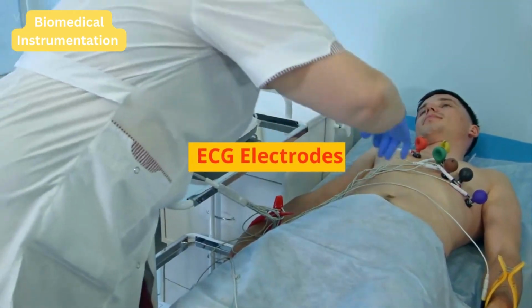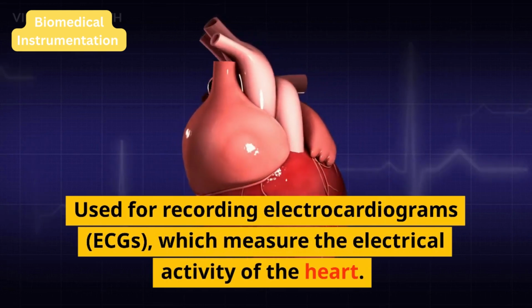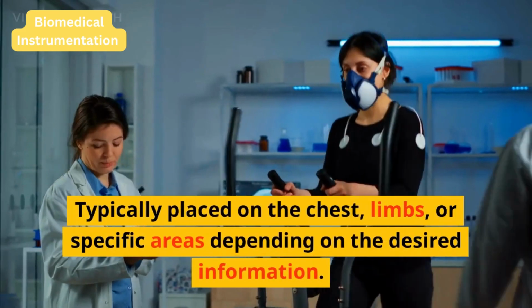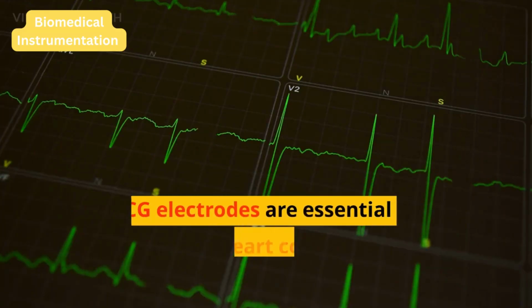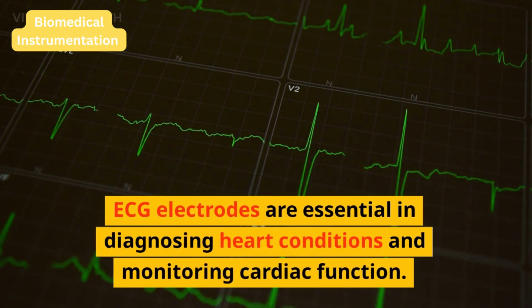ECG electrodes. Used for recording electrocardiograms, ECGs, which measure the electrical activity of the heart. Typically placed on the chest, limbs, or specific areas depending on the desired information. ECG electrodes are essential in diagnosing heart conditions and monitoring cardiac function.